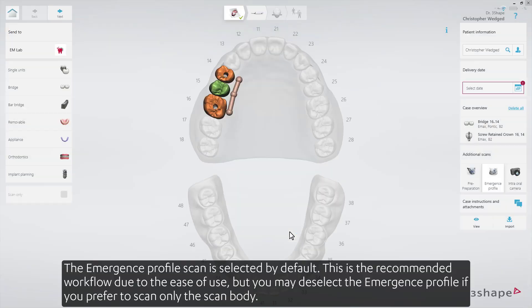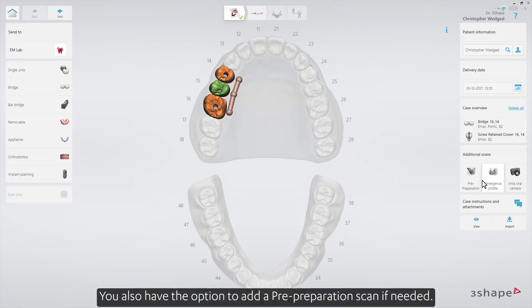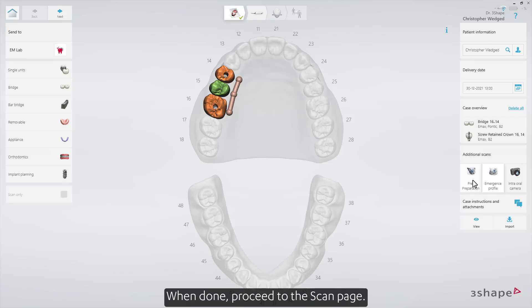The Emergence Profile Scan is selected by default. This is the recommended workflow due to the ease of use, but you may deselect the Emergence Profile if you prefer to scan only the scan body. You also have the option to add a pre-preparation scan if needed. When done, proceed to the scan page.